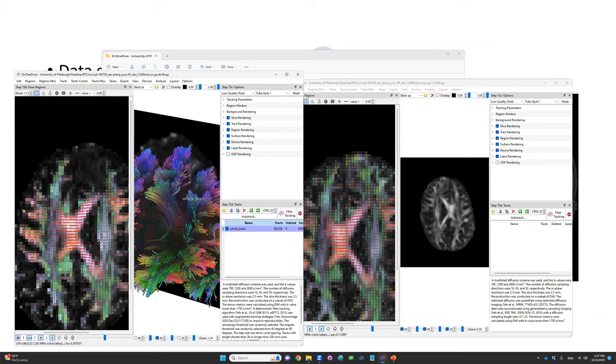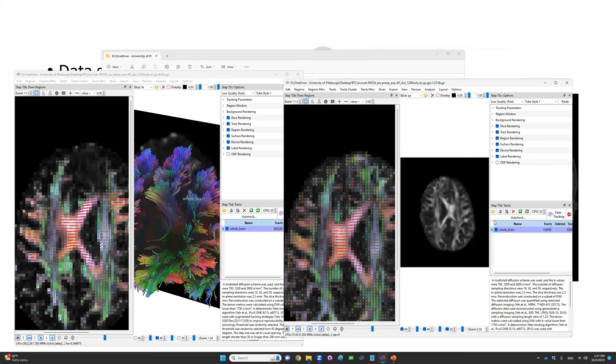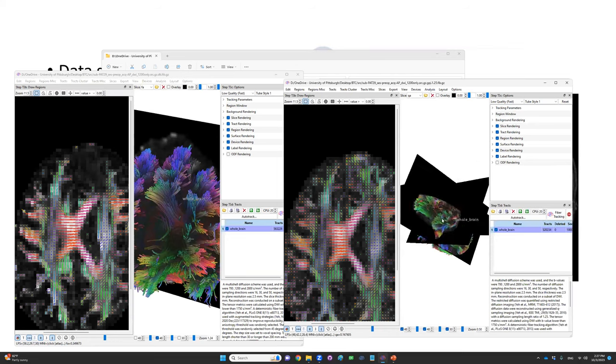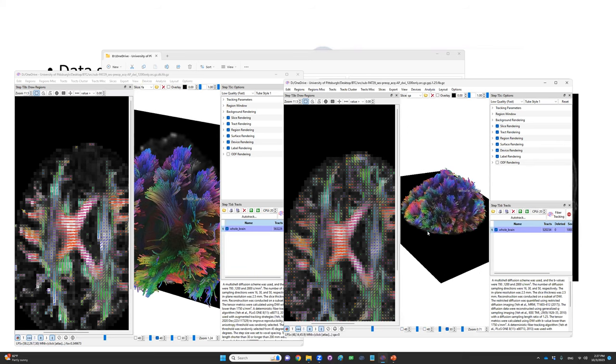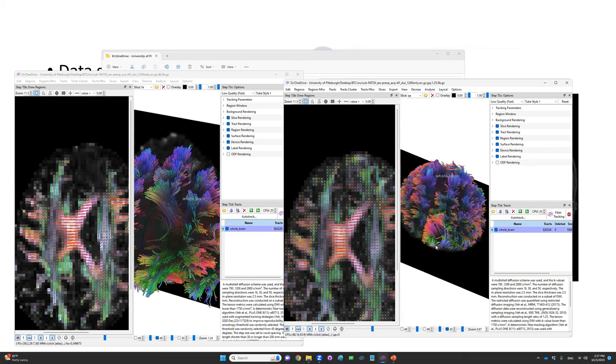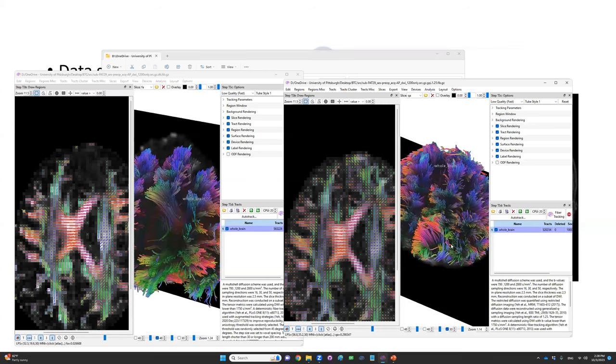For DTI methods, it's suggesting the tumor already destroyed all the fibers. But the GQI method is showing a lot of fibers still lining up. It's not like there's no fiber remaining in the tumor region. Running fiber tracking based on GQI methods suggests there are still fibers that have been pushed around, compressed. There are some high anisotropy value regions as opposed to no anisotropy regions here.